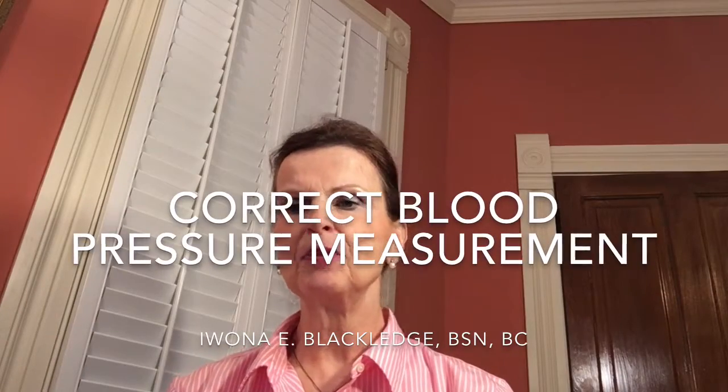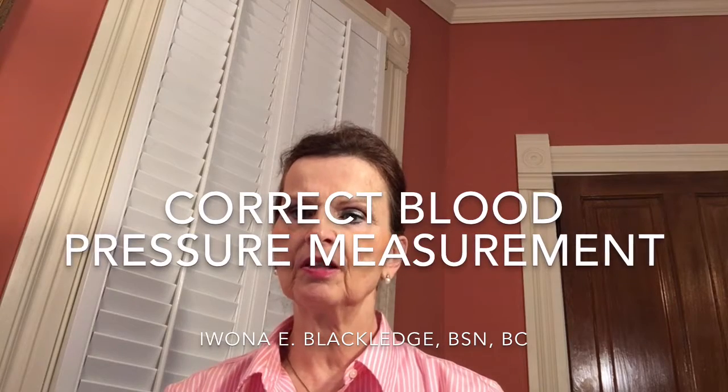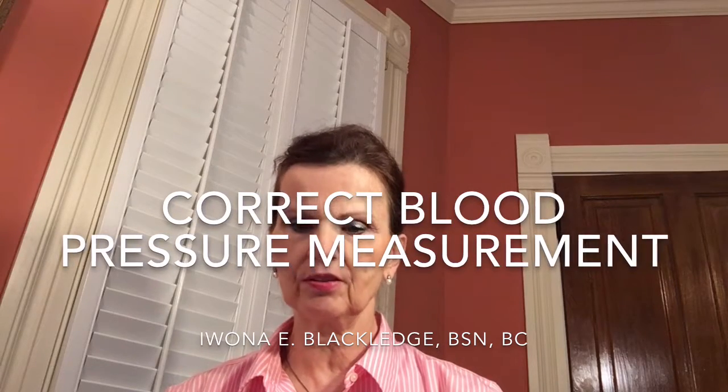Hello, my name is Ms. Blackledge, and the video you will be watching is on correct blood pressure measurement. However, I wanted to cover a few things.